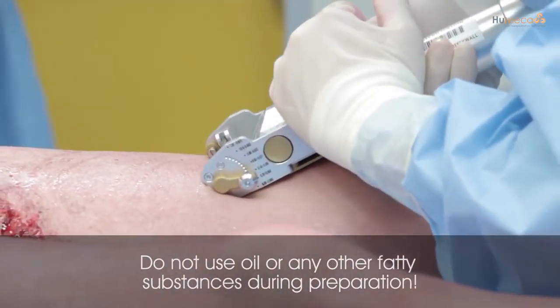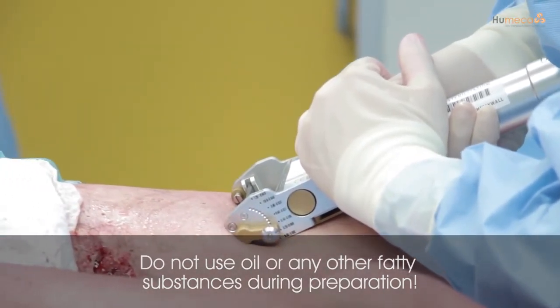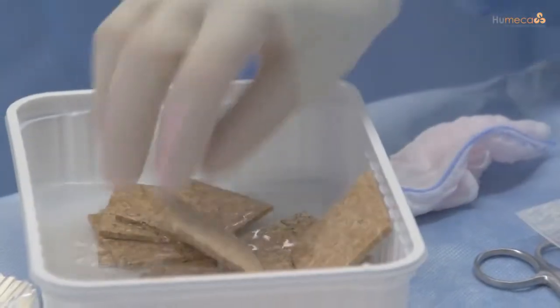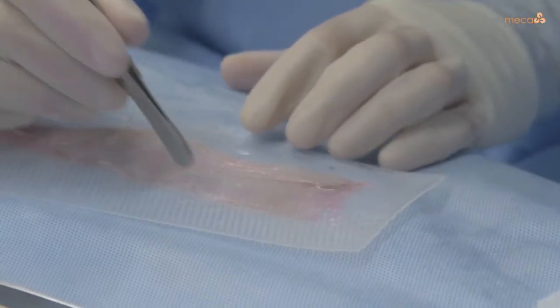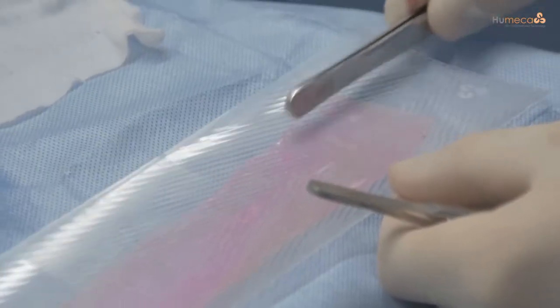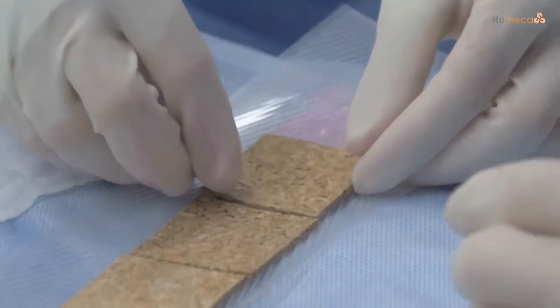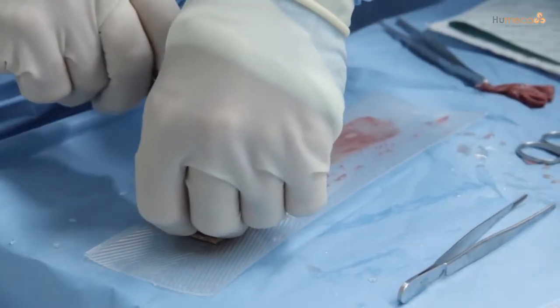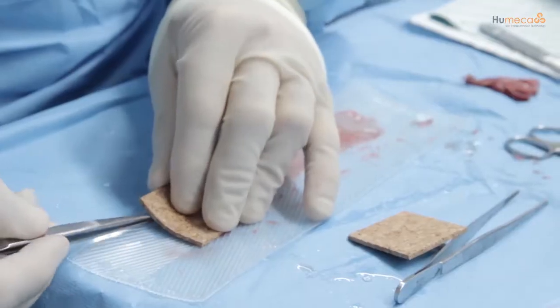Do not use oil or any other fatty substances on the ward and during graft harvesting, because oil prevents the glue from sticking the graft to the gauze. Make sure the cork plate is wet but prevent the pre-folded gauze from getting wet. Spread the graft completely on a sterile surface with the epidermal side down, then place the cork plate on the dermal side of the graft and cut the graft to the exact size of the cork plate.